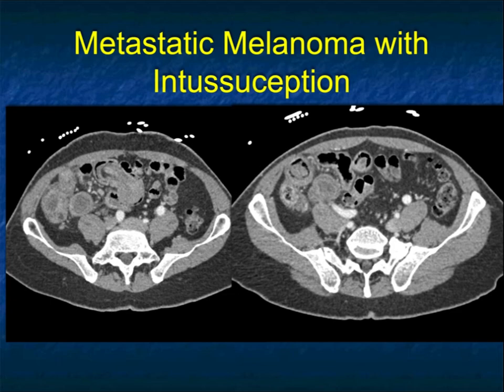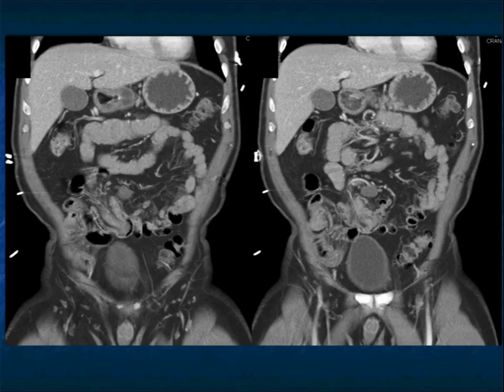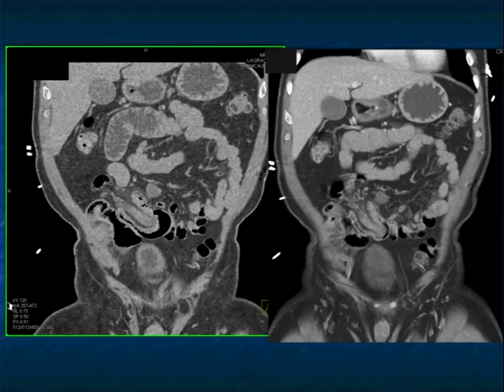Here's a nice example of intussusception in the right lower quadrant — in fact, multiple intussusceptions. This was metastatic melanoma. I'm covering two points here: intussusception can occur with small bowel tumors both benign and malignant, and there can be overlap between their appearances. Don't forget about metastatic disease. METs are becoming more common as a cause of small bowel tumors, particularly melanoma.